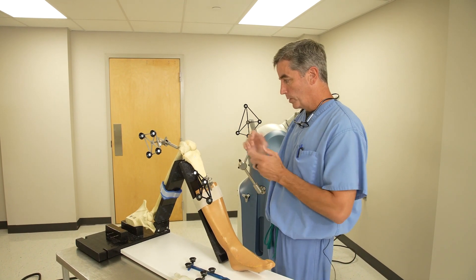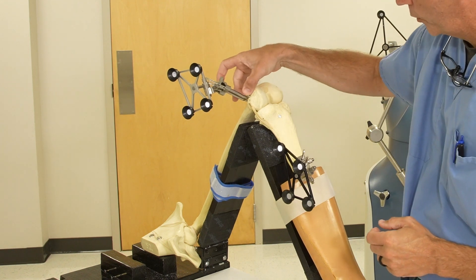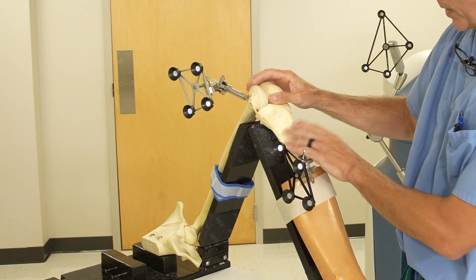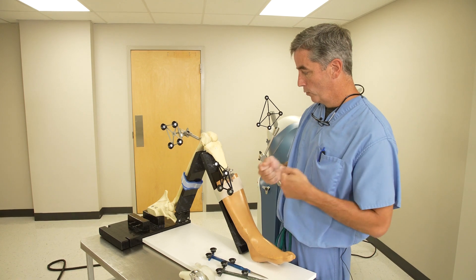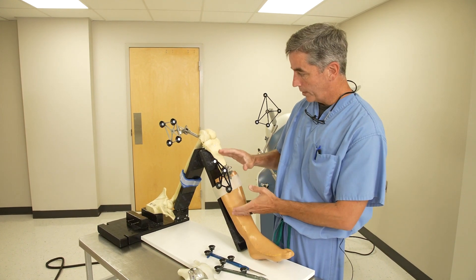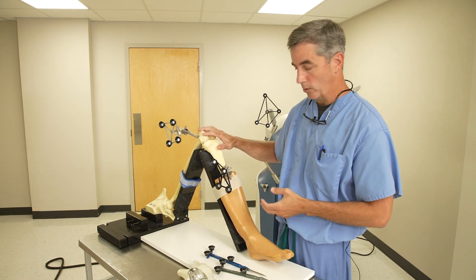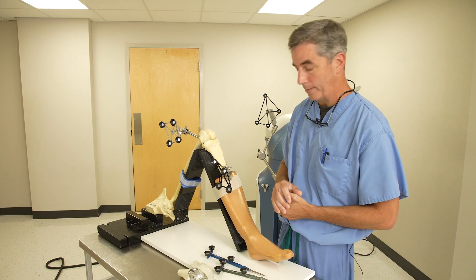So once we start the total knee and expose everything, we attach these pins — two pins here, two pins down here to the bone. So now when we move the leg, which we do during the surgery, this moves with it and maintains the orientation, or maintains the reference for the robot and the computer.